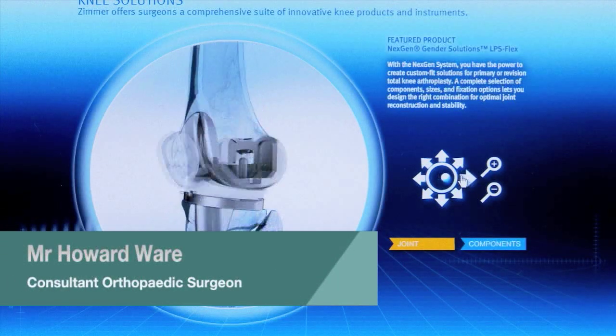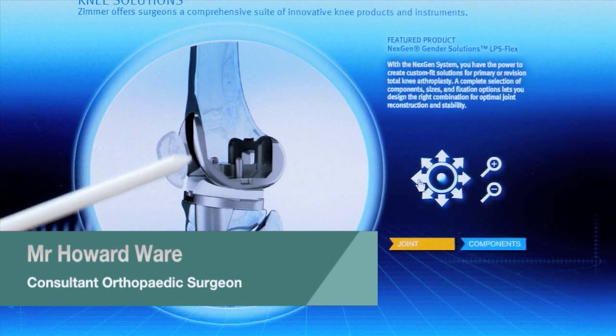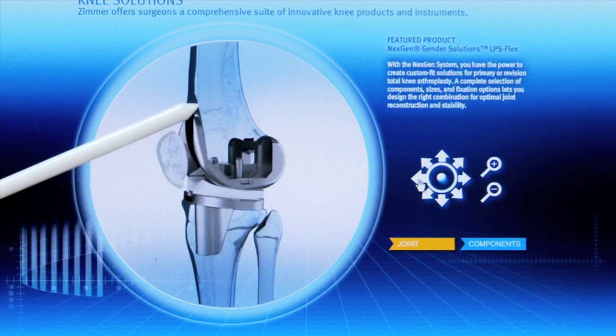And the front. Now if we put it back to the side, here we've got a metal cobalt chrome femur — that's the joint replacement, the femoral component.